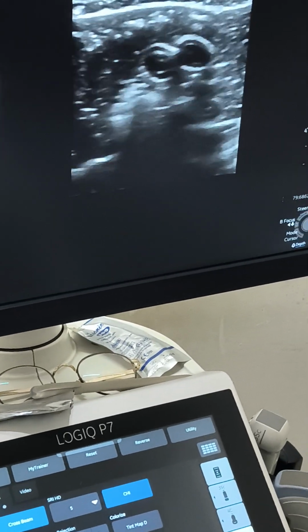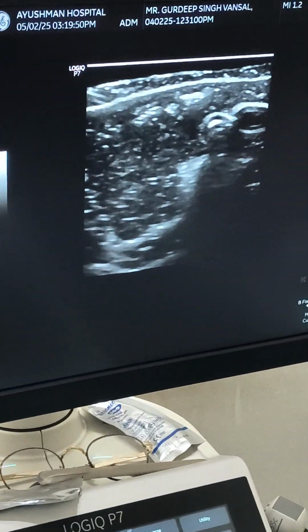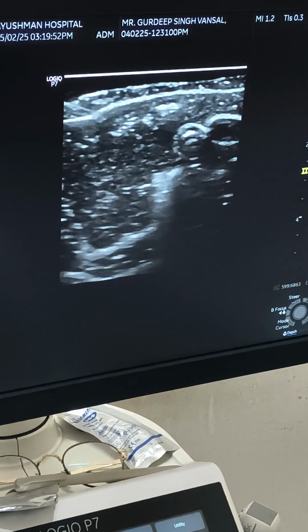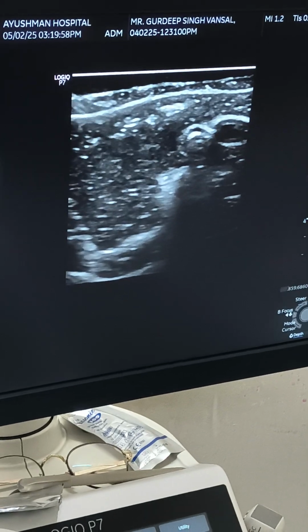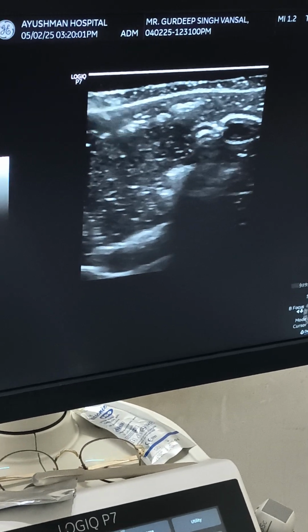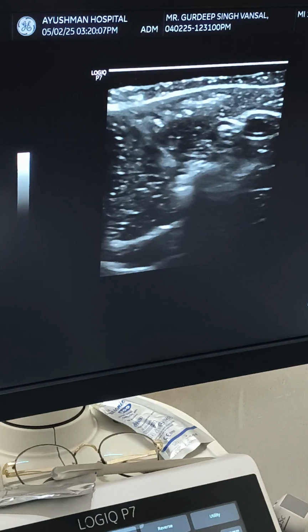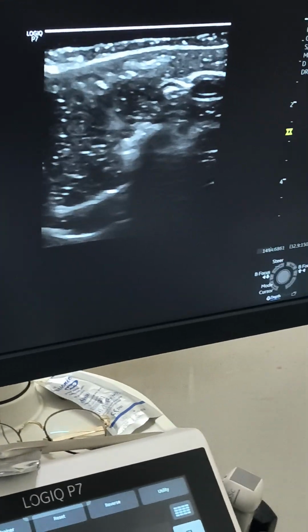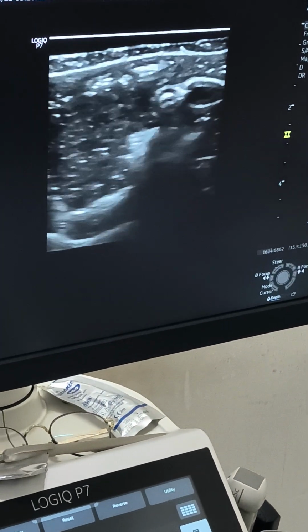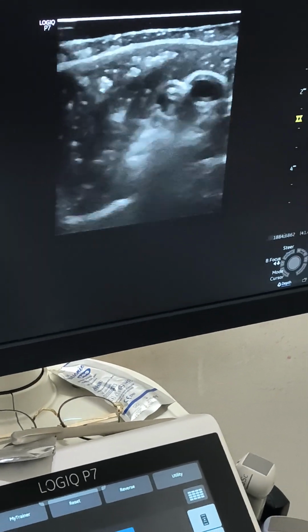Again I'll show you how I am going to target. Again the angle. Now see, my angle is shallow, so I am advancing toward the vessel, but I need to be a little bit steeper, right? So maybe 45 degrees. Now I am approaching the nerve. So this is my angle, approximately 45 to 50 degrees. You must visualize the tip all the time. So this is how you can target practice on our simulator. Okay, coming to the third one.